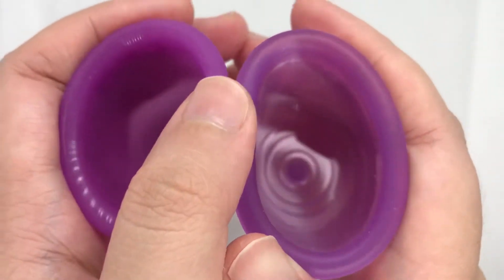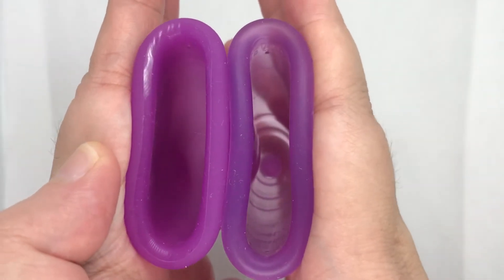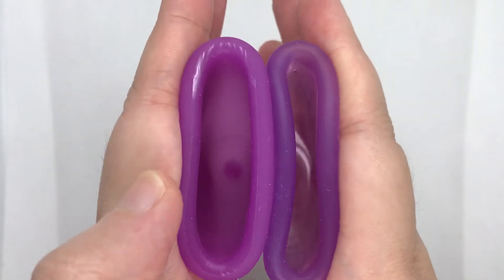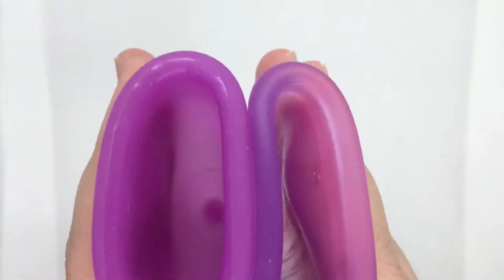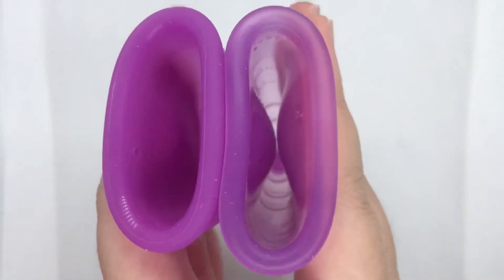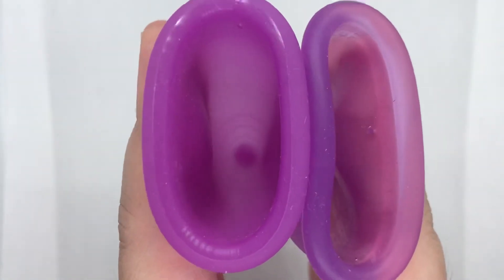Comparing the rims, you can see how really firm the Lunette is. Comparing the body, you can see that the Ruby Cup has a soft body, while the Lunette is really firm.